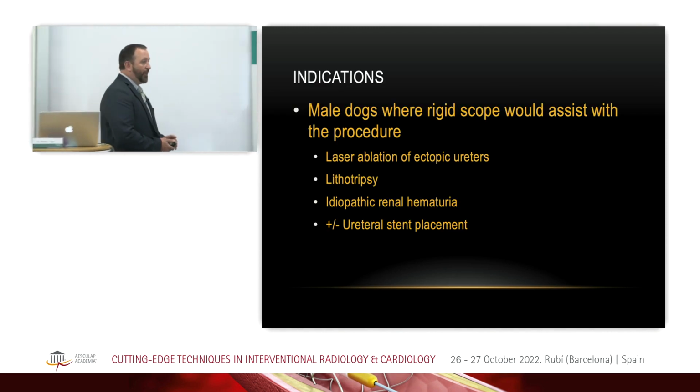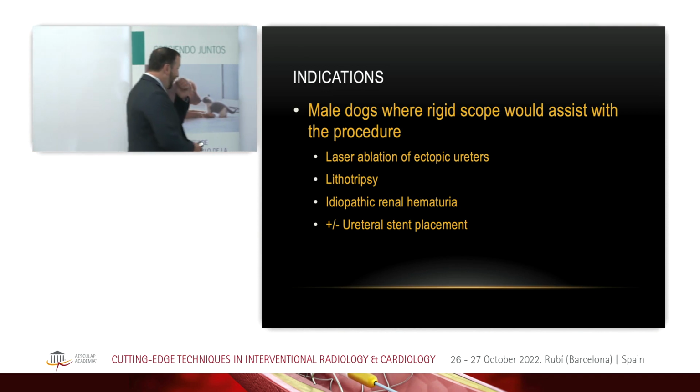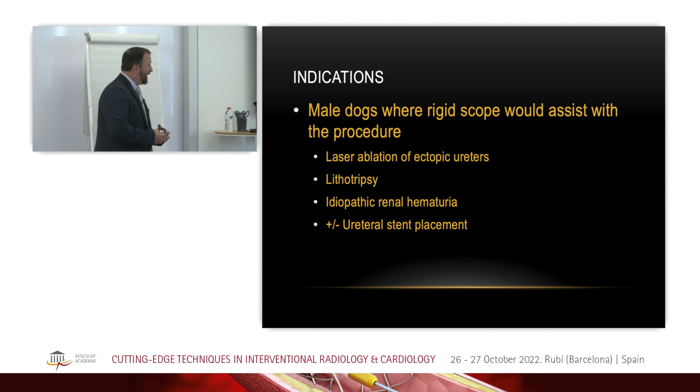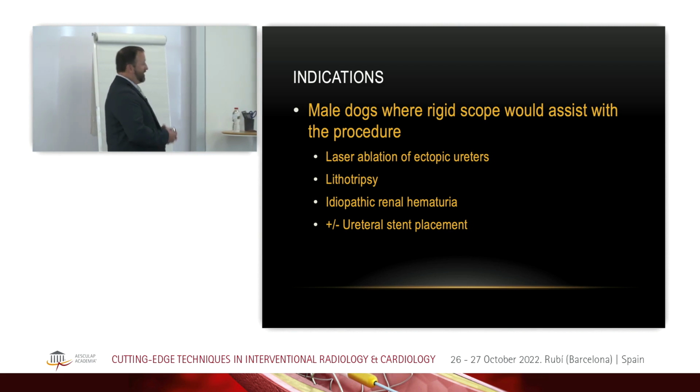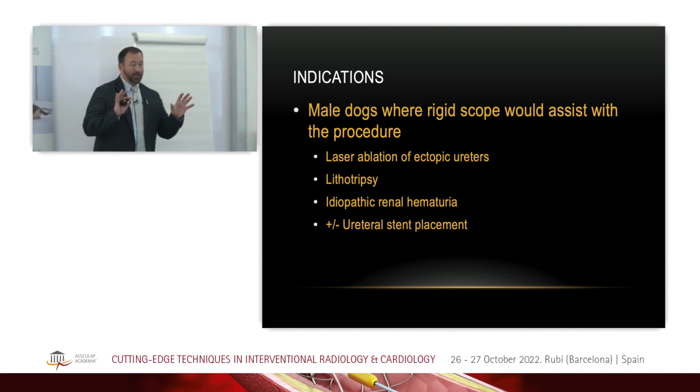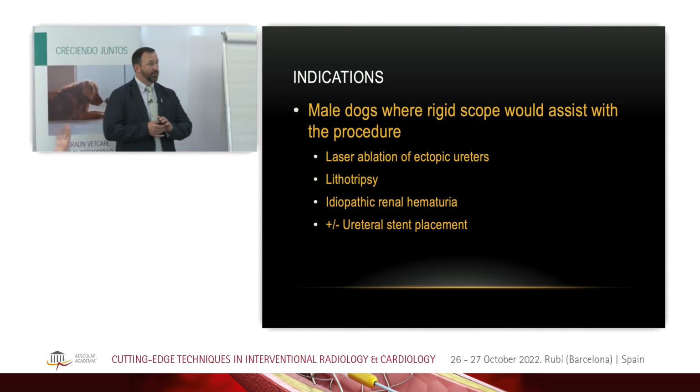Okay, what's another technique for lower urinary tract? This is one that we really like and one that you should think about if you're doing scoping and procedures where it's easier to use a rigid scope. Who in here is doing endoscopy? Anyone using scopes? Yeah, so a few of us.